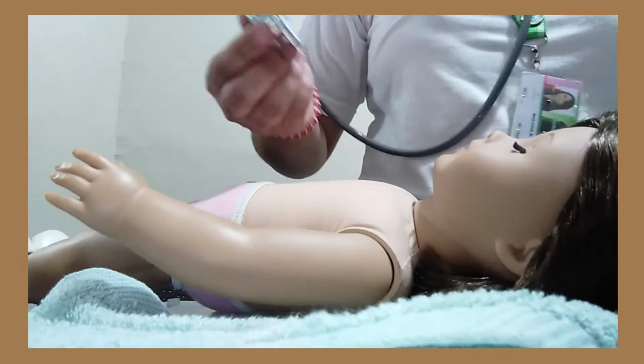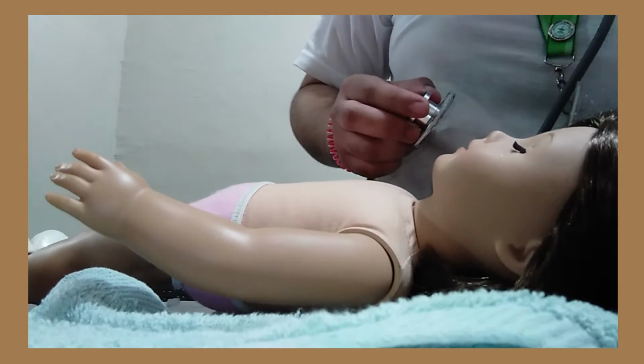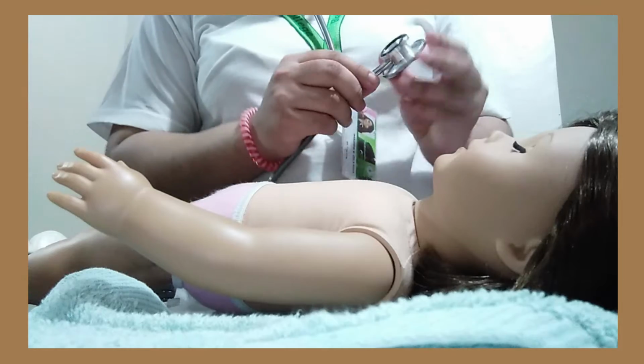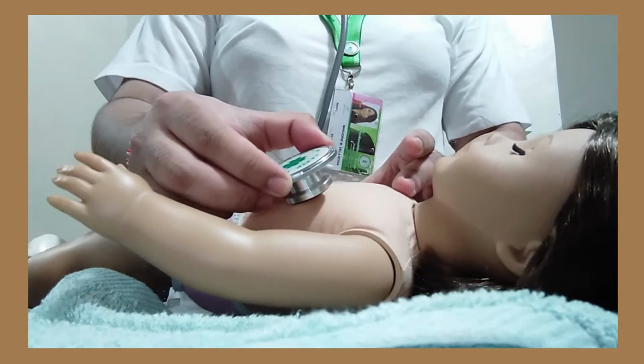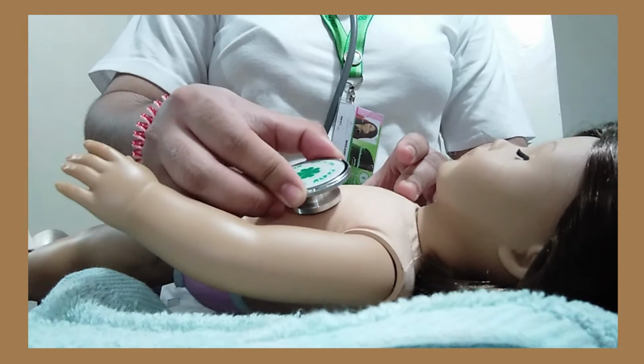Okay, so now I'm going to be changing to the bell of the stethoscope and listen to the heart in the same sequence. So, I'm going to be changing it first. Ma'am, take a deep breath in, deep breath out, then begin.